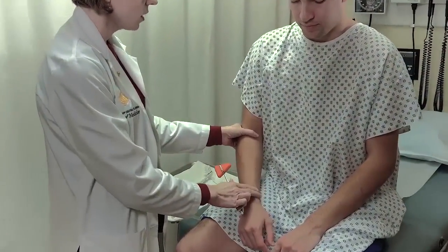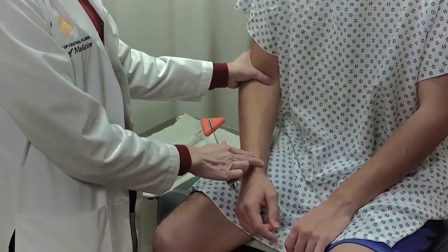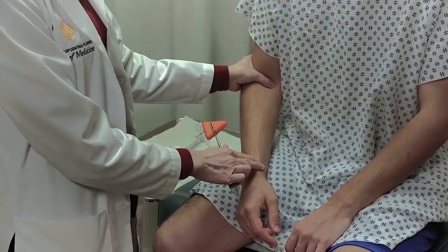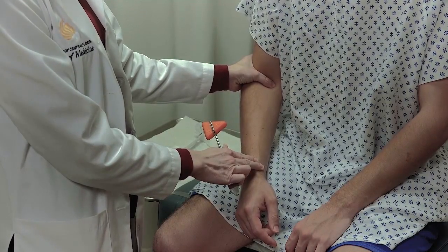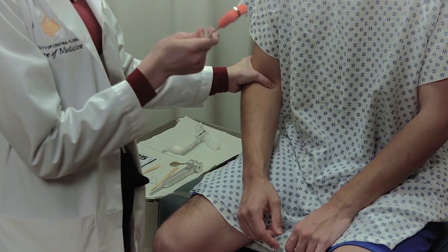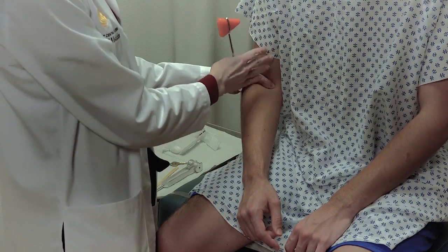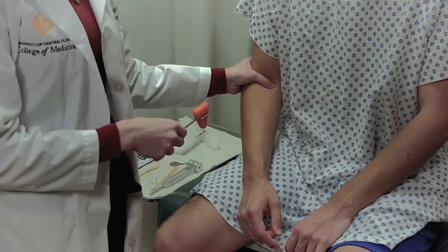The biceps reflex is tested on the biceps tendon. The patient's arm should be relaxed in their lap. I'm going to put pressure on the biceps tendon in order to stretch it a little bit, and then strike the tendon with the reflex hammer on my own finger. I should be able to feel the reflex in my hand even if I can't see it in the muscle contracting.